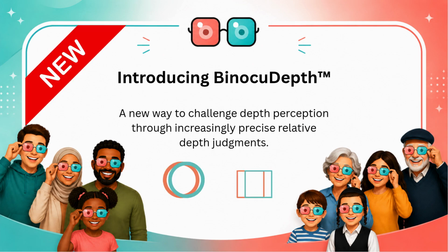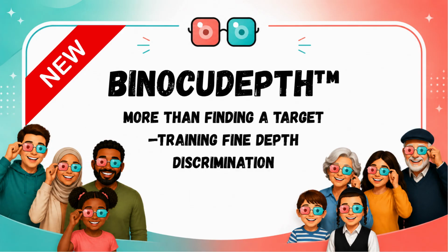Hi there, we're introducing a new activity into BinocuFit. It's called BinocuDepth. This is a new way of training that depth perception for really developing an increased ability to make fine depth discrimination judgments.